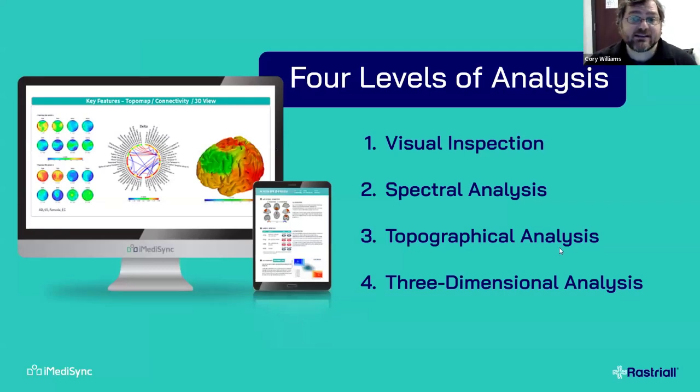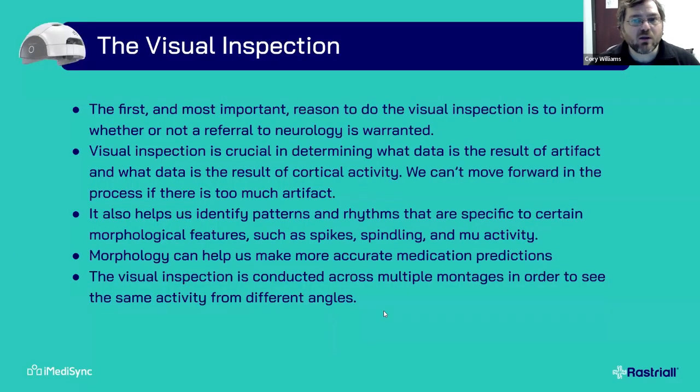When we analyze that data, there are 4 kinds of steps that we go through. There's a visual inspection, a spectral analysis, a 2-dimensional analysis, and a 3-dimensional analysis. Now, I could talk for probably an hour on each one of these things. I'm not going to. You're welcome, or I'm sorry. You can take whichever you want. But I am going to touch on each one briefly, just so you can get a quick look at what does this mean, what does this do, how do we use it.